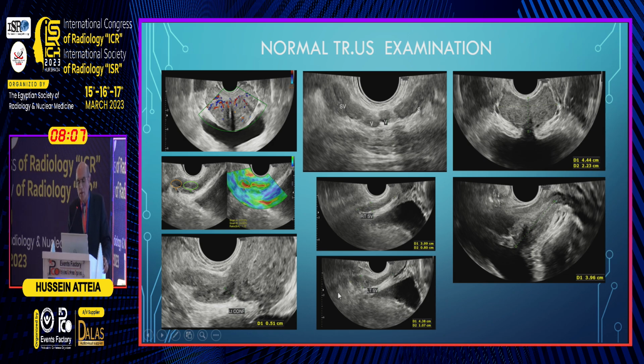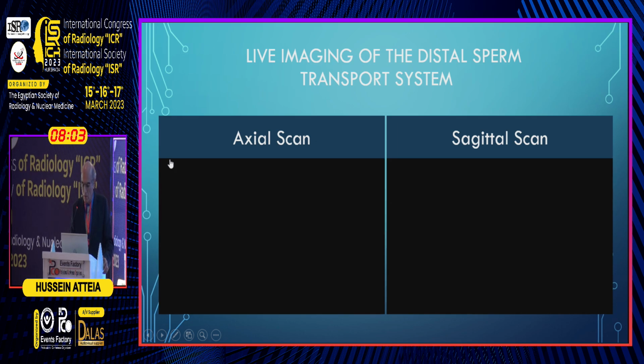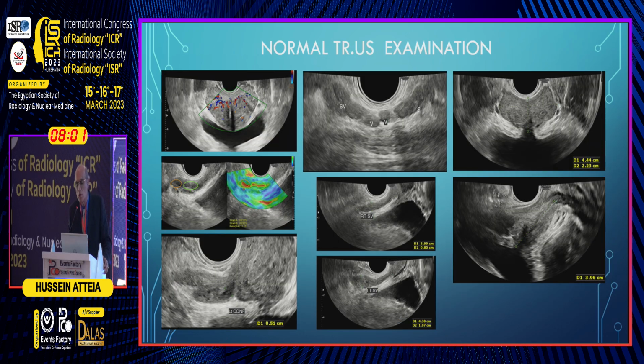In the axial plane, you could see color Doppler you could use in cases of suspected prostatitis. You could use, even on the left here, you could see elastography in cases of seminal vesiculitis, end stage with chronicity and fibrosis of the seminal vesicles. Use elastography, more than one strain ratio will go towards the fibrosis, and the problem is seminal vesicle dysfunction.